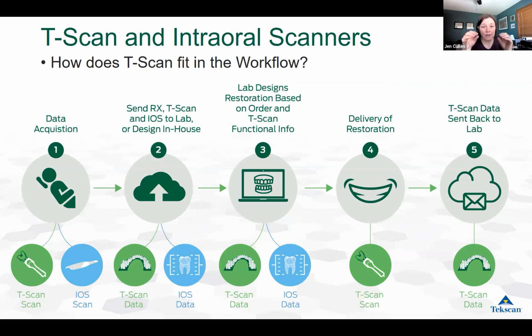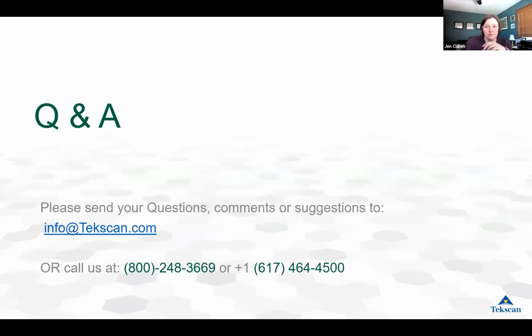They're actually used very closely together, right? If you think about using your intraoral scanner to get the data you need to design the best restoration, when you're delivering that restoration and you go into the patient's mouth, that's when you're going to use T-Scan to make sure that there's not high forces on that tooth, there's not an imbalance that exists. And I think there is some confusion out there, but they're two different technologies. They work very well together, actually, but provide different information. Absolutely.